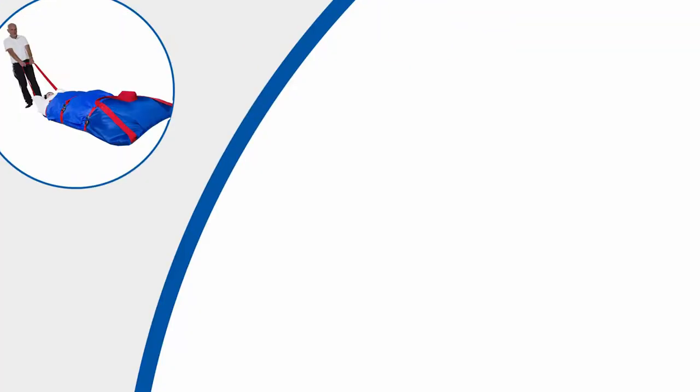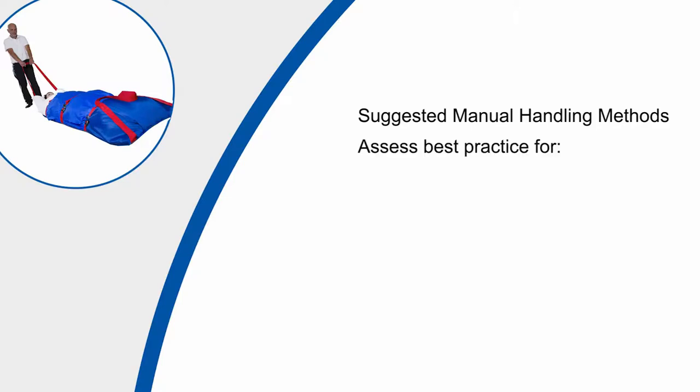Any manual handling techniques used within the video are merely suggested methods to move non-ambulant persons in an emergency. It is accepted that there may be other more appropriate alternatives on some occasions and within slightly different environments to those portrayed.